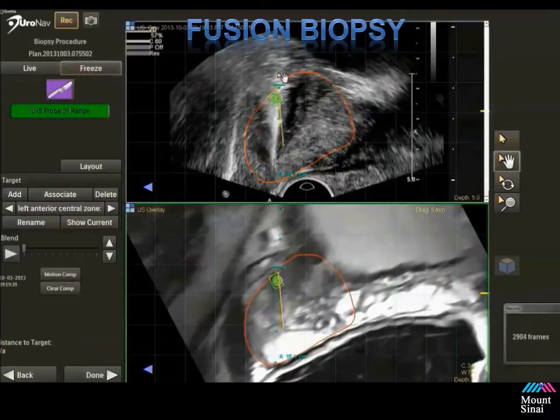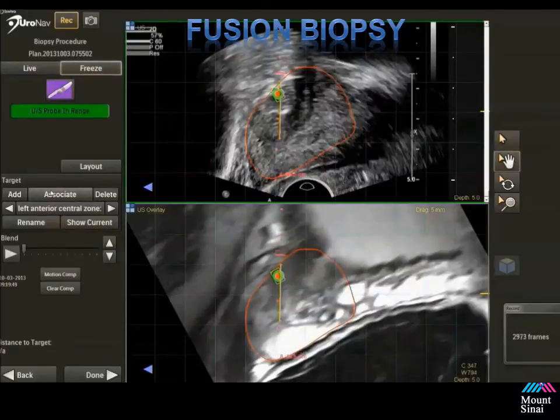And on all the fusion biopsy machines, if you look in the upper left-hand corner, the record button should be on so you can see how you did. You can track your progress. You can review the information with the radiologist to see how you're doing. I think it's important to understand that you must have pathology correlation when performing this to improve your technique as well as your radiologist's.